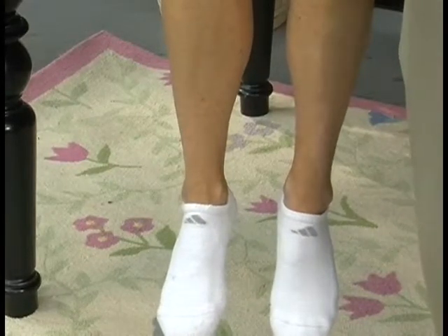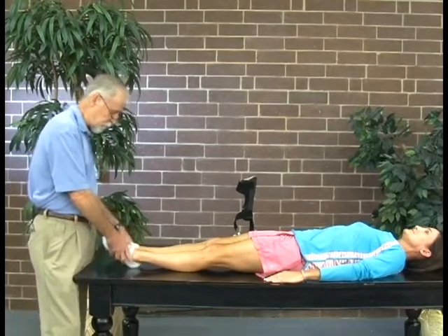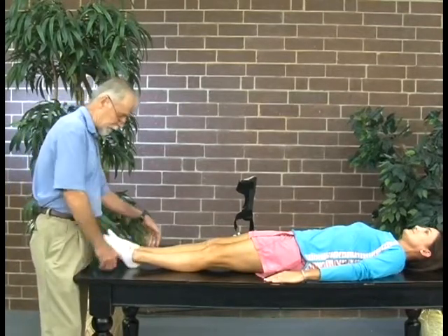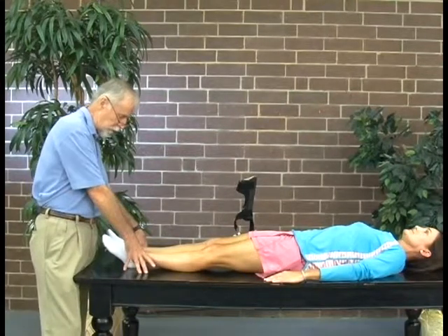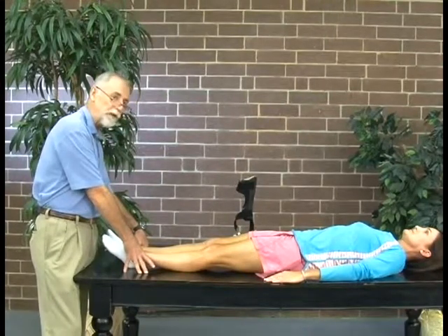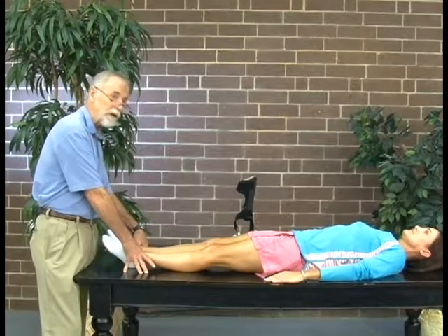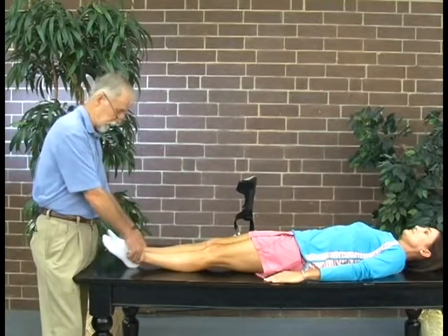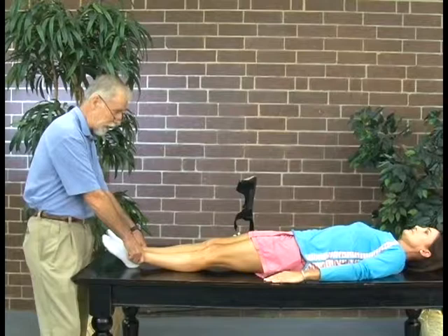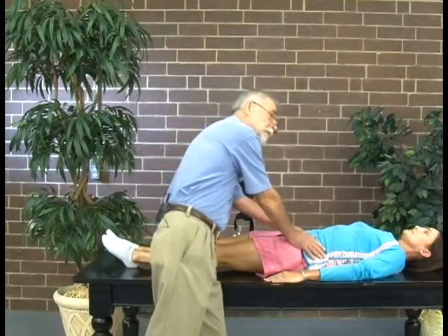The other factor we were dealing with with Beth was trying to balance a leg length difference. If you look at the medial malleolus on this side and the one on the other, there's about a two-centimeter difference — that's a pretty large correction we had to account for. If we didn't account for that, we couldn't level her in the shoe even if we had the right brace. So that's the first measure we're making — she lies very level now at her pelvis.